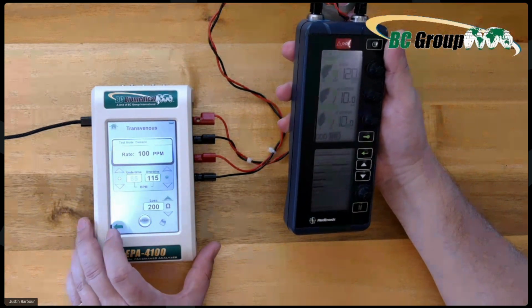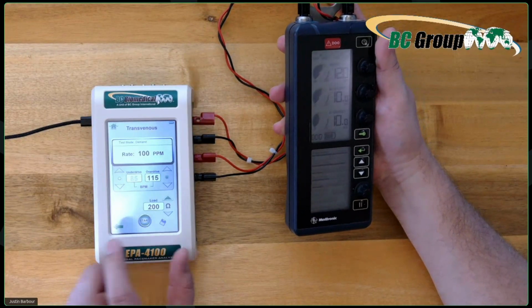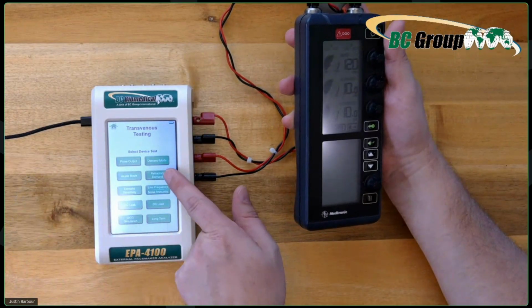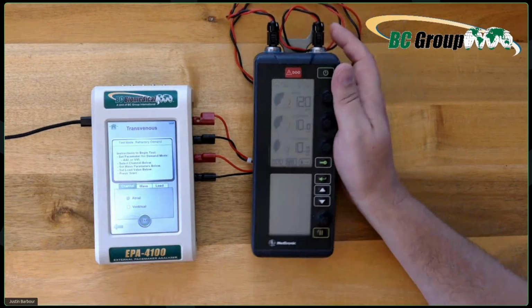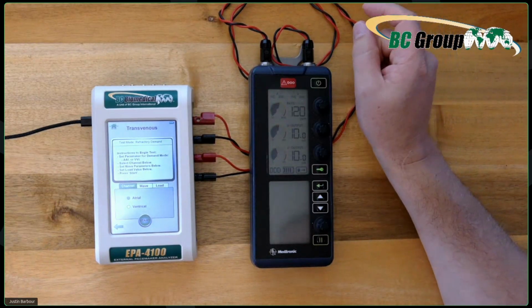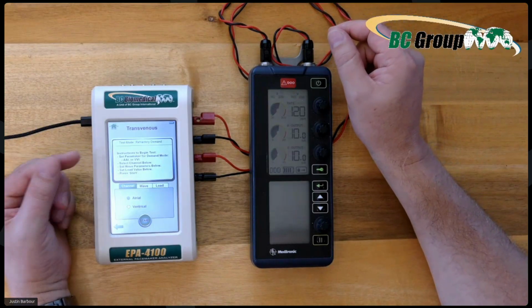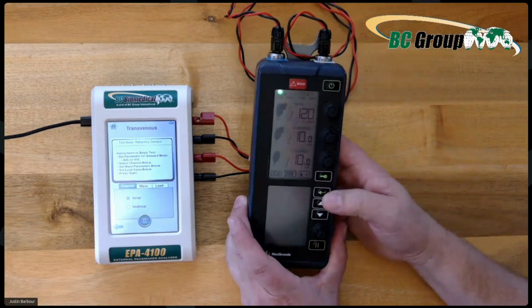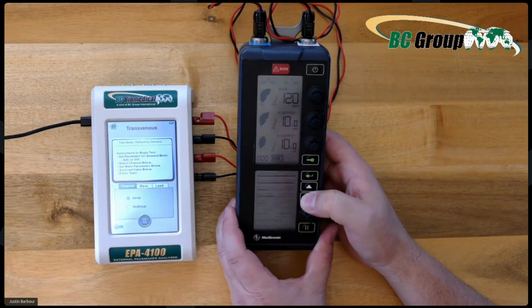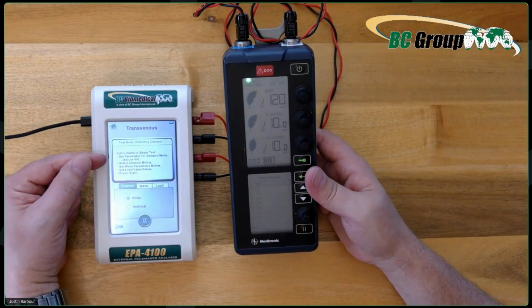So let's go back. We hit stop. You can see down here I have a save indicator, so I can save what it sensed. And we have async mode. We have refractory demand. And I want you to pay attention to right here. We have instructions on the beautiful touch screen with high resolution, and it tells you what to do. It says set pacemaker for demand mode, AAI or VVI. That would be this right here. So we unlock it and we go down to the modes, hit enter, and it says AAI or VVI.